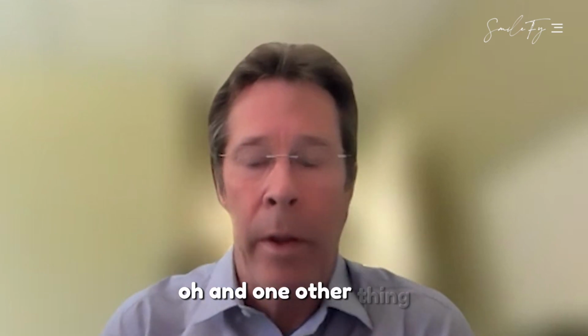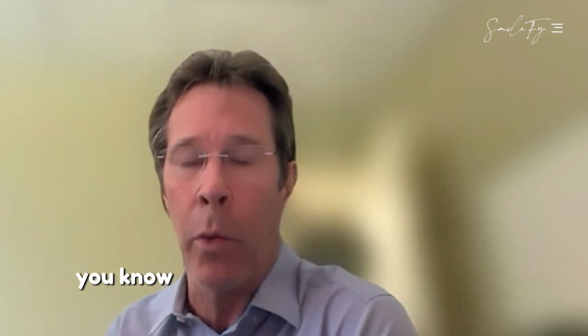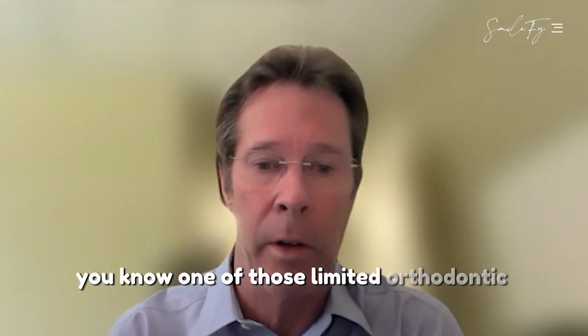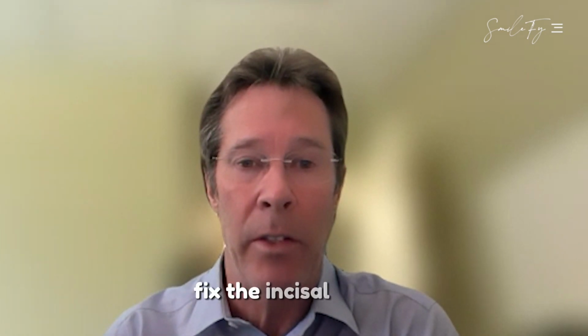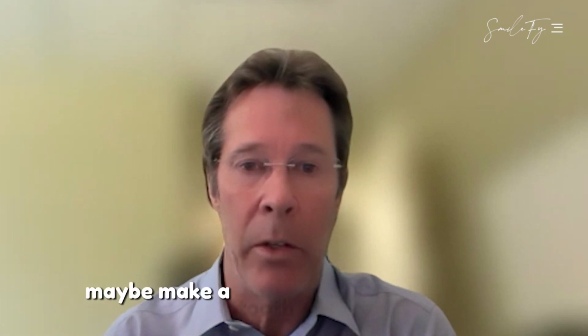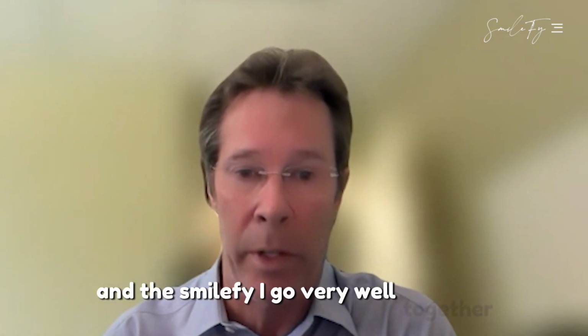Oh, and one other thing, Invisalign and SmileFy go wonderful together. What I can do is, again, the patient decides they want to straighten the front teeth, one of those limited orthodontic interventions. We can straighten the front teeth and then fix the incisal edges, maybe make a tooth look a little bit better in alignment because they're missing an incisal edge. So the Invisalign and the SmileFy go very well together.